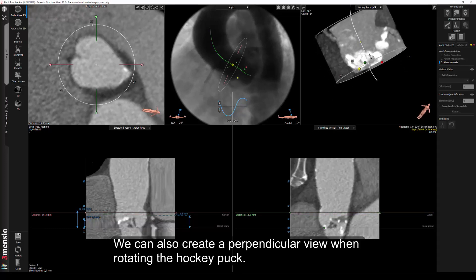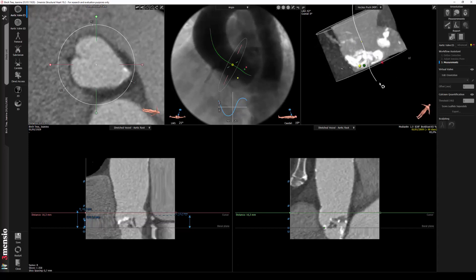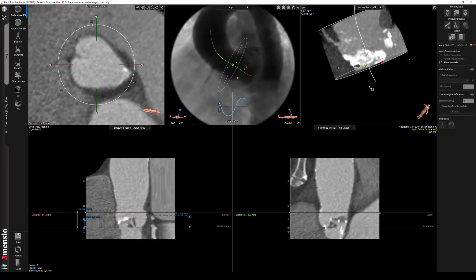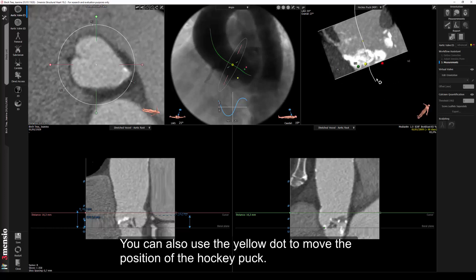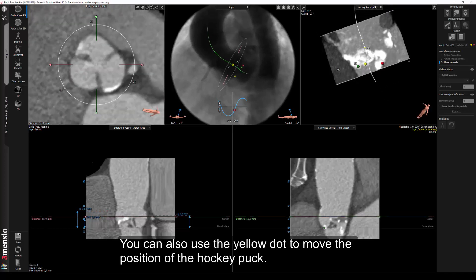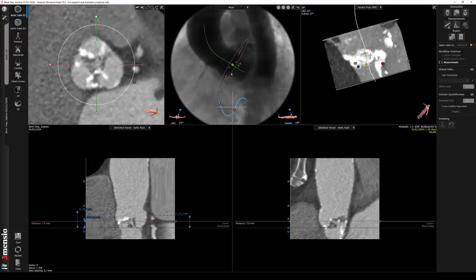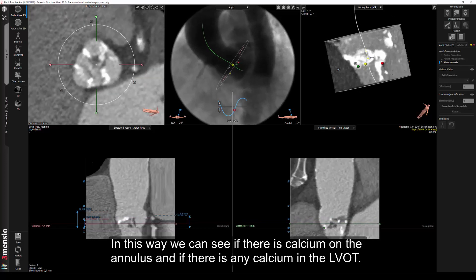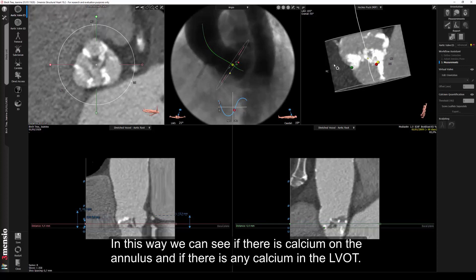We can also create a perpendicular view when rotating the hockey puck. You can also use the yellow dot to move the position of the hockey puck. In this way, we can see if there is calcium on the annulus and if there is any calcium in the left ventricular outflow tract.